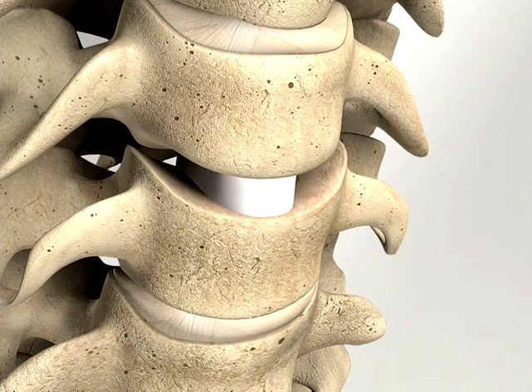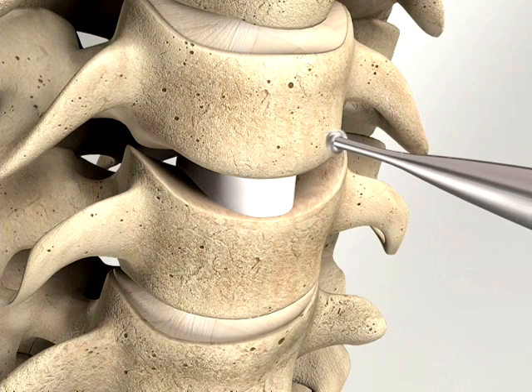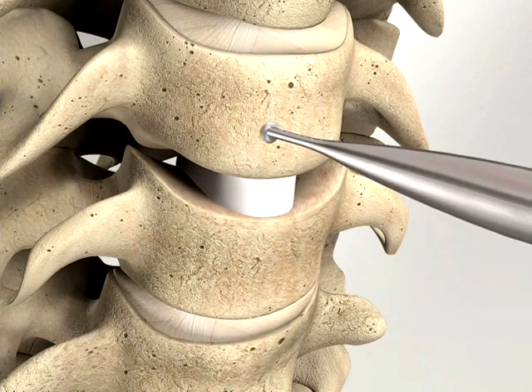Thorough decortication of the anterior aspect of the vertebral bodies with either a burr or rongeur prepares a smooth, even surface for the placement of the Inion S1 plate.